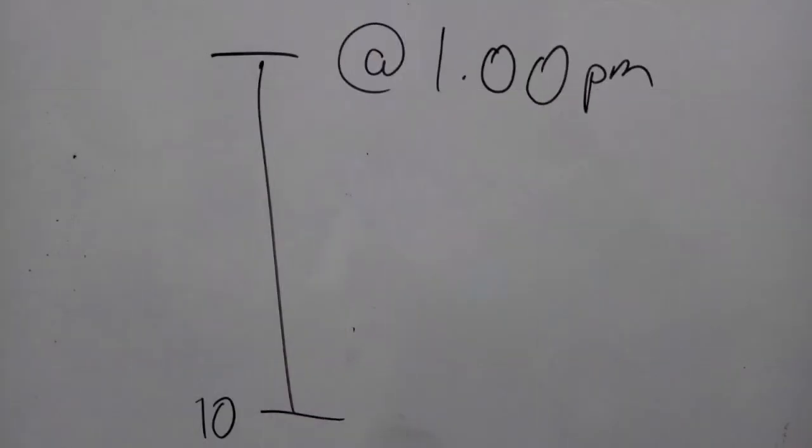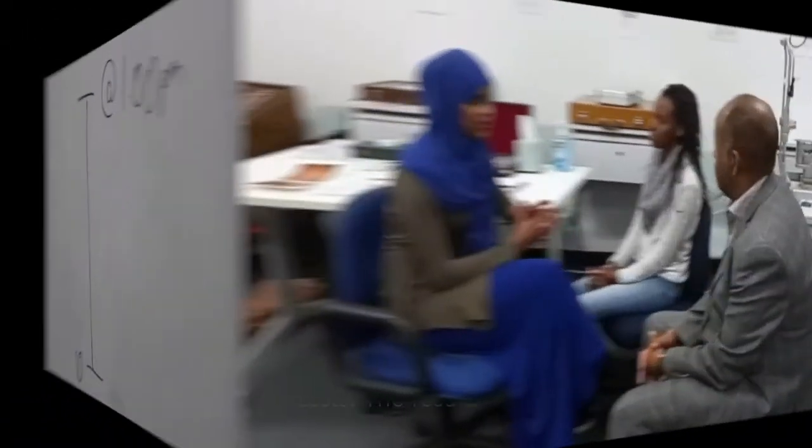So now back to Charlotte's results. Her IOP or intraocular pressure was found to be at 10 mmHg at approximately midday, which is within normal limits. The normal limits are between 10 and 21 mmHg. So based on this tonometry measurement, amongst other measurements, Charlotte's fall has had no significant effect on her eyes or her eyesight.